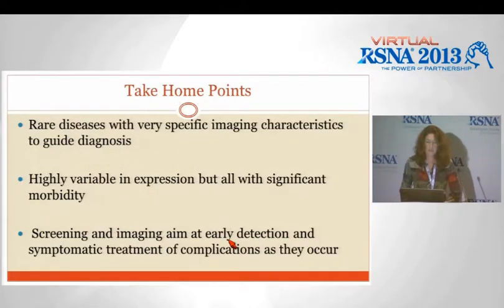These are all rare diseases with very specific imaging characteristics to guide diagnosis. They are highly variable in expression, but all with significant morbidity. And screening and imaging aim at early detection and symptomatic treatment of complications as they occur.